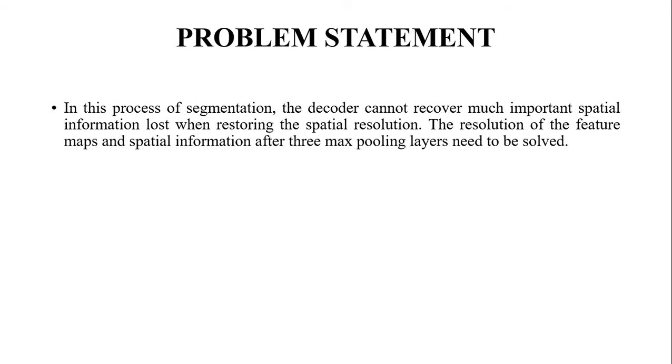Problem statement. In the process of segmentation, the decoder cannot recover much information; spatial information is lost when restoring the spatial resolution. The resolution of the feature maps and spatial information after 3 max pool layers need to be solved.